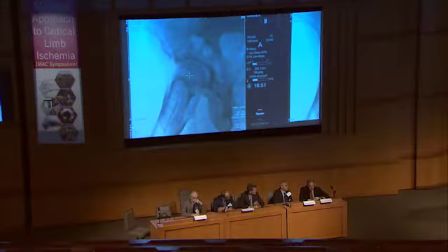Because now you are in the left oblique position here, and usually the offtake of the SFA comes on the other side, yes. It is easier to see on the right oblique position. So I would, to be honest, go back right in a second. Yeah, I agree, Tom. I think that's.